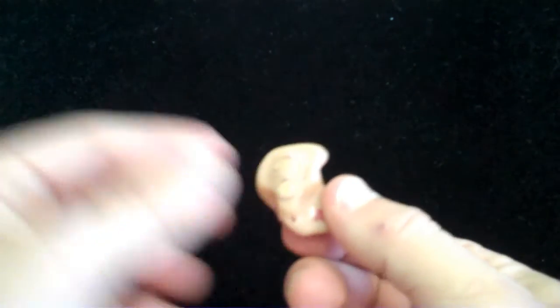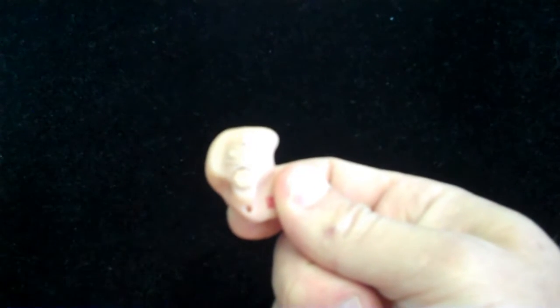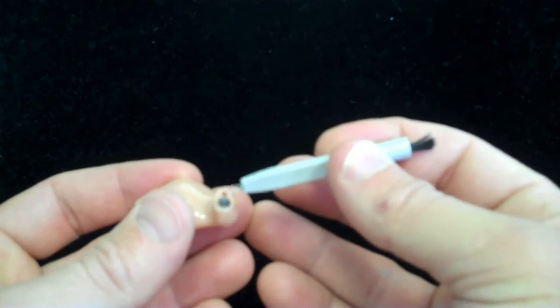Now, the other common style of hearing aid is a custom in-the-ear hearing aid. I realize this one is bigger than most of them, but the cleaning procedure is really much the same regardless of size, so I chose the largest one for demonstration purposes. Same as the behind-the-ear hearing aid, our primary interest is to keep the sound opening and air vent on this device open and free of blockage.